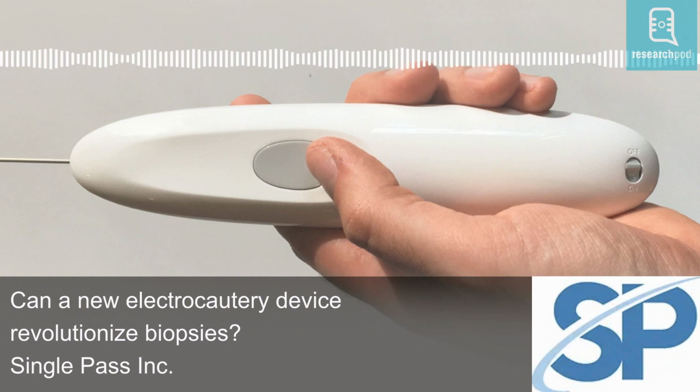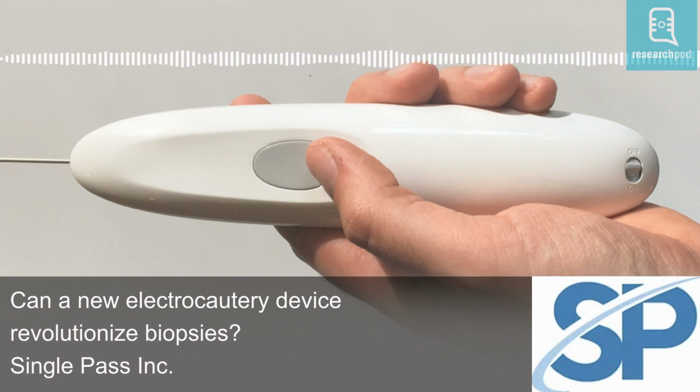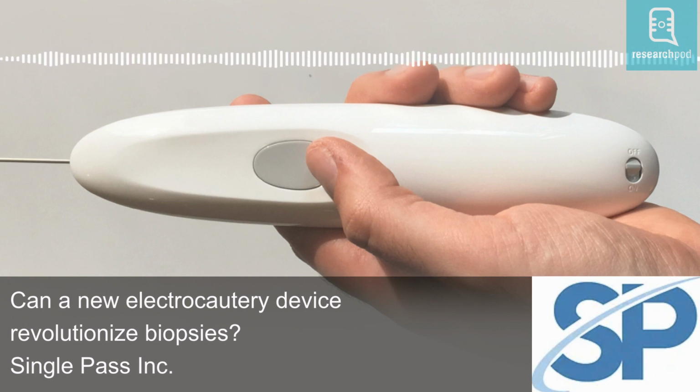For future developments, Dr. Sonnenschein and Dr. Hirsch have also said they want to find a way to detach the probe and keep the handle for reuse. They want to improve ergonomics for one-handed use and make the device available for traumatic hemorrhage occurring outside the hospital. However, the immediate focus will be on further studies to prove its safety in human patients.